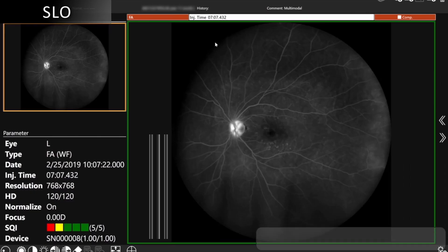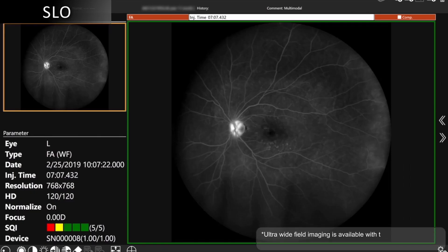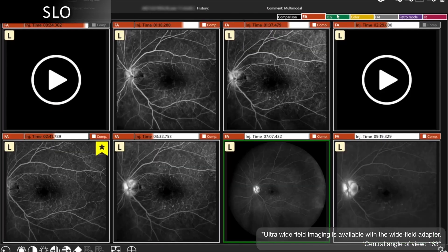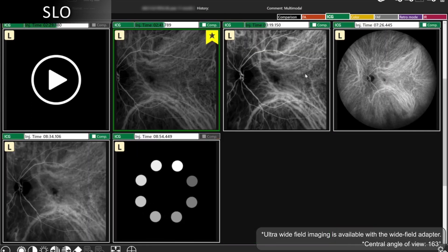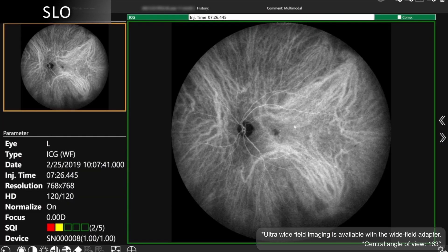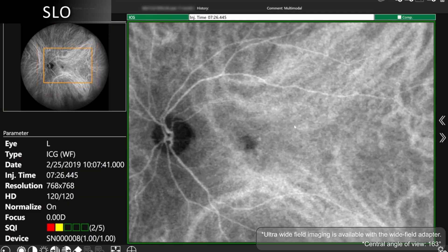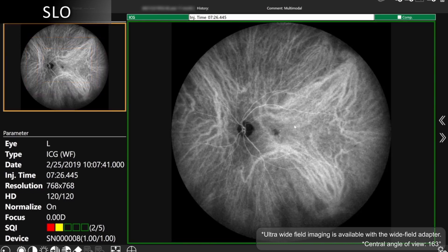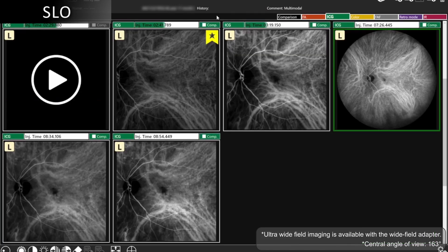We can look at ultra wide field 163-degree images of fluorescein and ICG, and zoom into an area that we are concerned about.